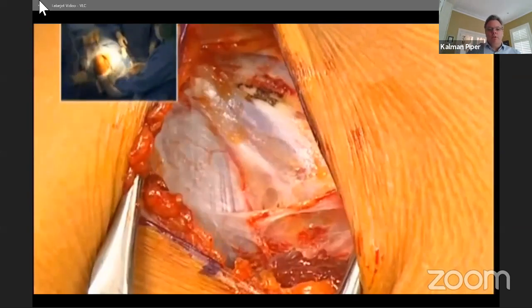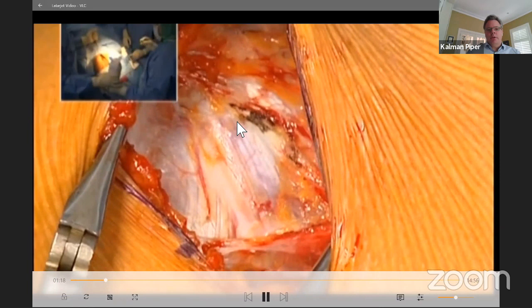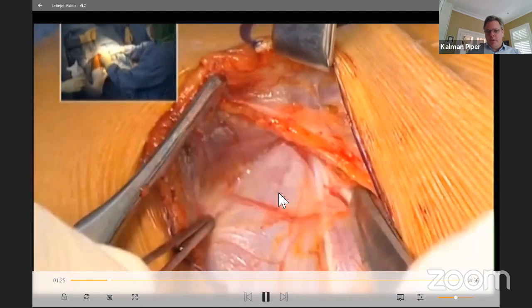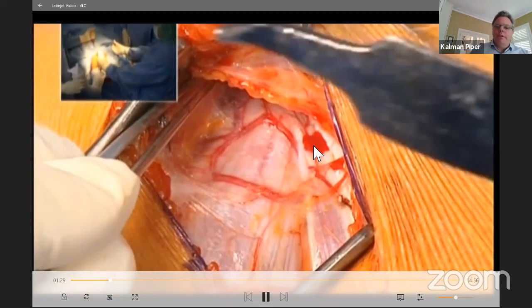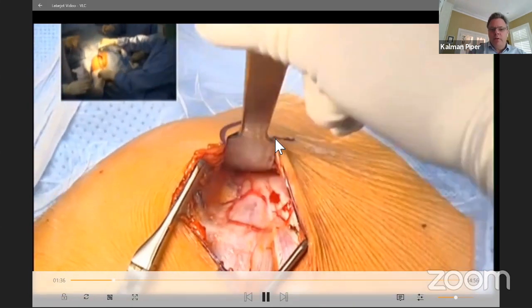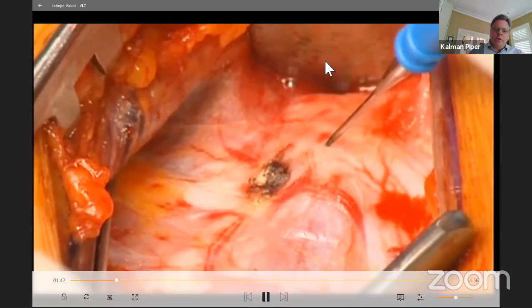So there you can see the conjoint tendon. The tip of the coracoid process is here, and a retractor is placed at the top of the coracoid process. Here it is, and it's a spiked Hohmann, and it can be difficult, but you want to try and balance that on the angle of the coracoid process at the back, so you can see the entire superior surface of the coracoid process.